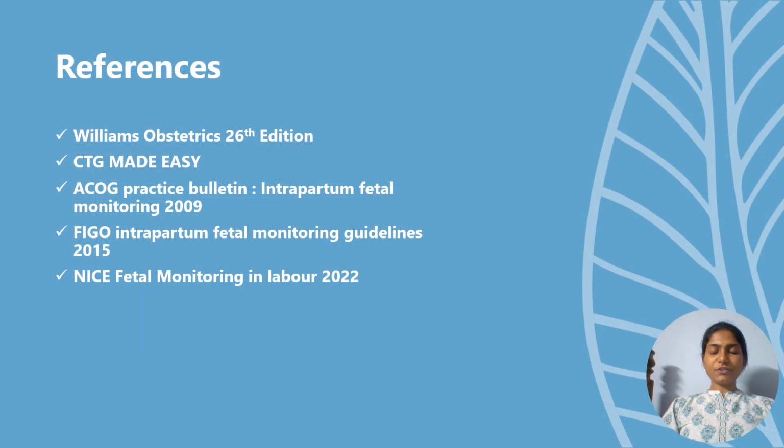So this comes to the end, and I hope all of you have understood the importance of CTG. We have to definitely identify the components of CTG, whether they belong to the white, amber or red color, categorize whether it is normal, suspicious or pathological, do the corrective measures, continuously assess the ongoing risk, and expedite the birth if the corrective measures are not working.